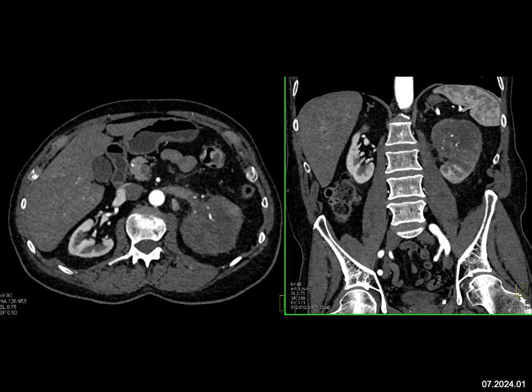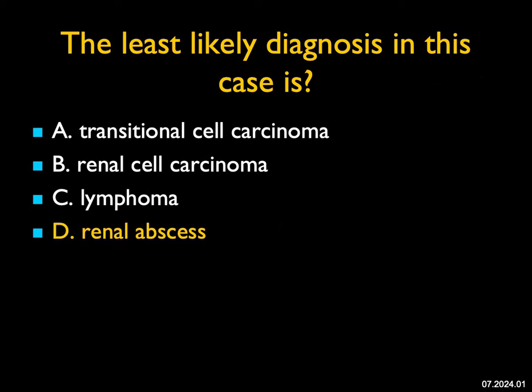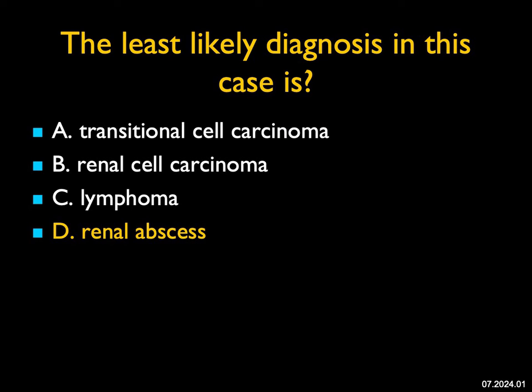The thing this is least likely is an abscess. Abscesses have all sorts of appearances, but they're typically hypodense, often cystic. You often will see changes in the peri- and pararenal space with an abscess. The sharp margins of this and the lack of increased density — the appearance is most consistent with transitional cell carcinoma, and a renal abscess is the least likely possibility.